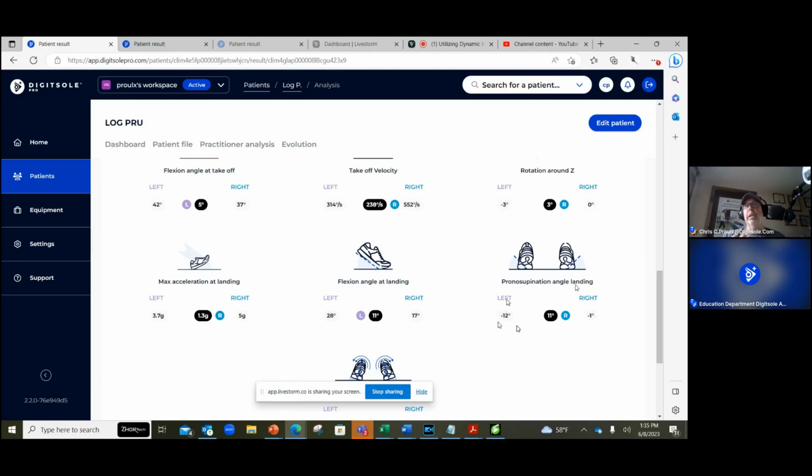This is why I look at running and jumping characteristics, because I want to see if this matches up a little bit. So he's definitely within that normal position. If I start to see greater than 20 or 25 degrees, it means that they've got a lot of heel inversion, and that may put them at danger for a plantar flexed inversion ankle sprain, right? So that's definitely something to take into consideration. But this is very normal.